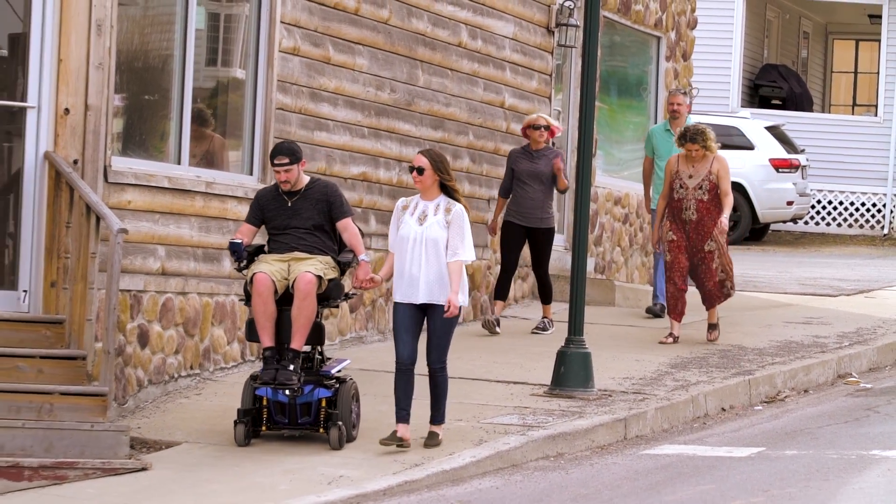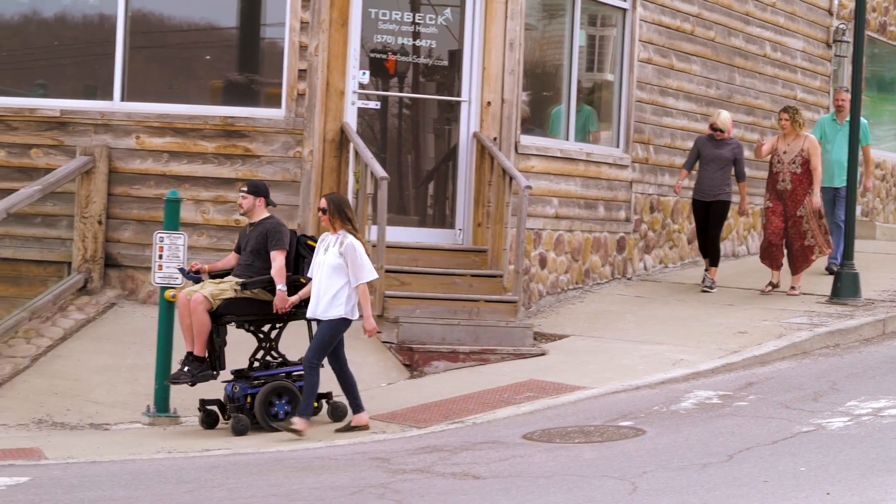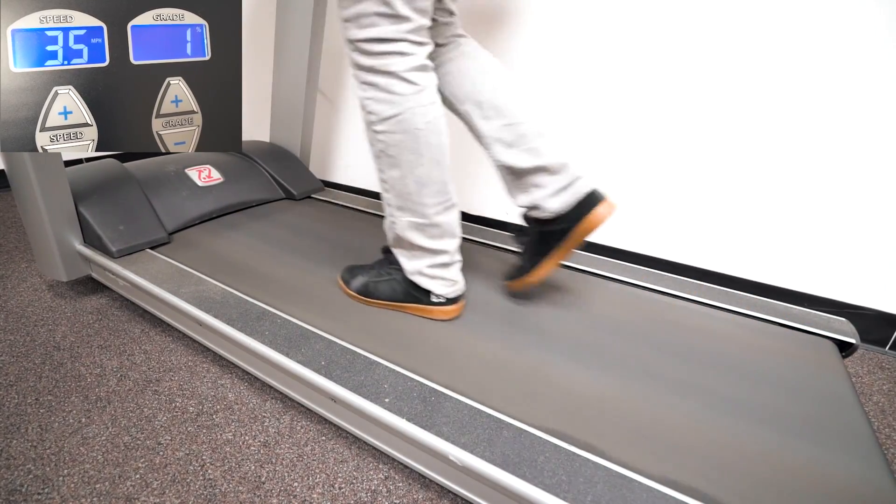You might be wondering what iLevel is. iLevel allows someone to drive their Quantum Power Chair up to 4.5 miles an hour at 12 inches of elevation. Think about it — that's faster than someone walking on a treadmill.